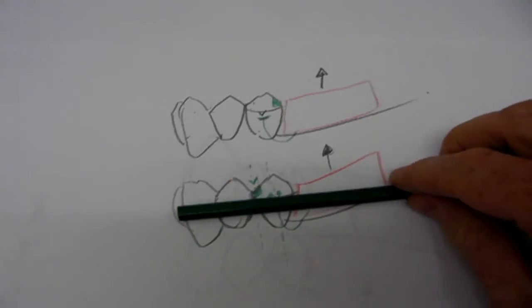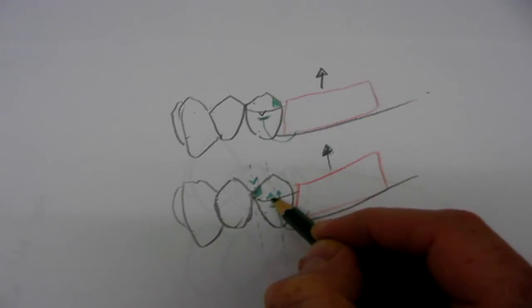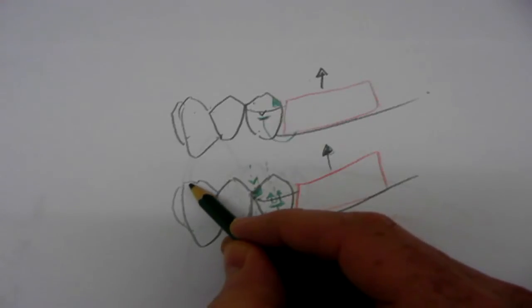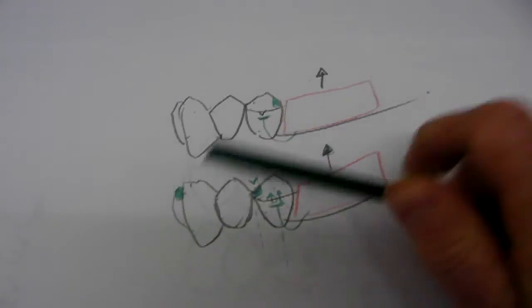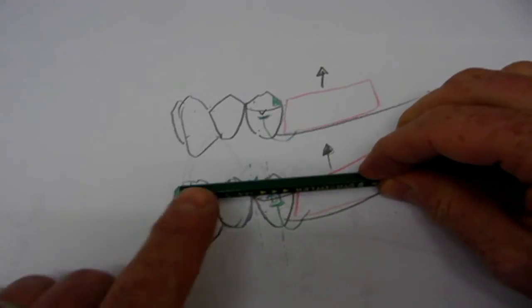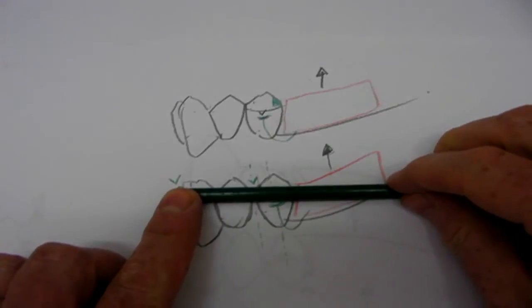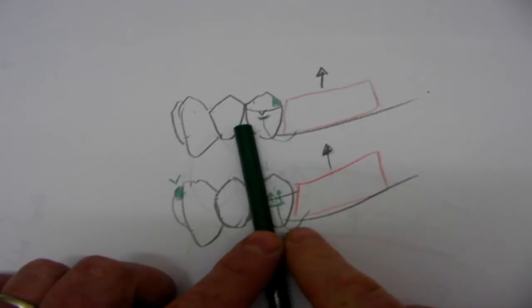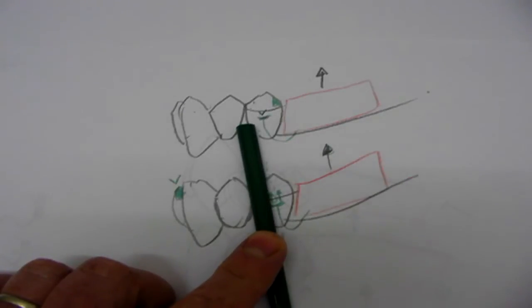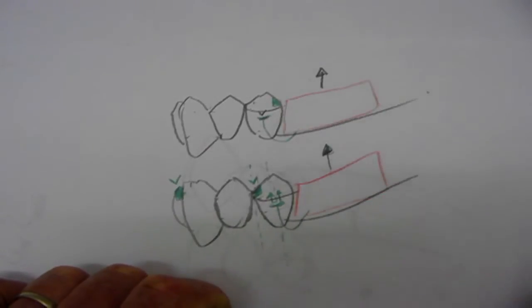And when you start thinking about this, the further we have this occlusal rest from the clasp tip in the saddle area, the better. So if we had an incisal rest upon one of the laterals or the centrals, not very aesthetic I know, but if we did that, that would be the best indirect retention, because we'd then be rotating around this point here, and the clasp tip would have to move up the tooth even in a more parallel direction to the long axis of the tooth. So this is indirect retention.